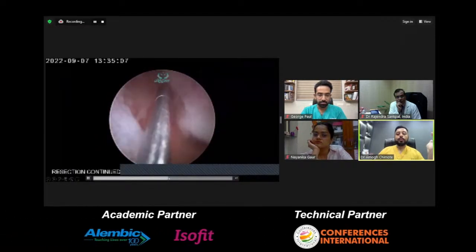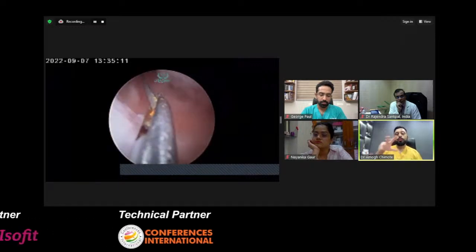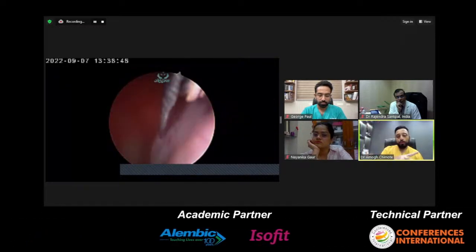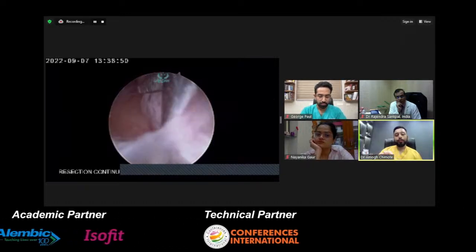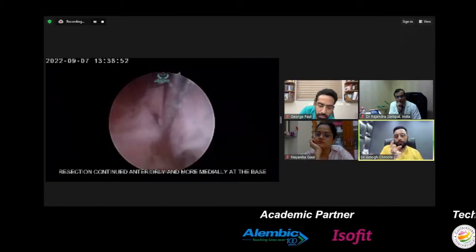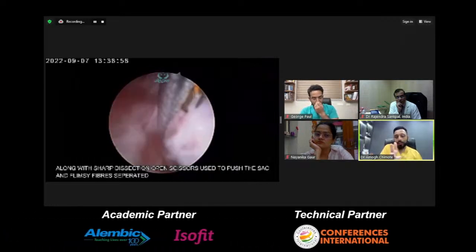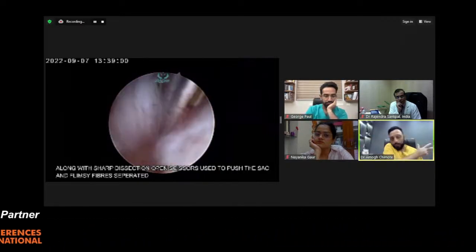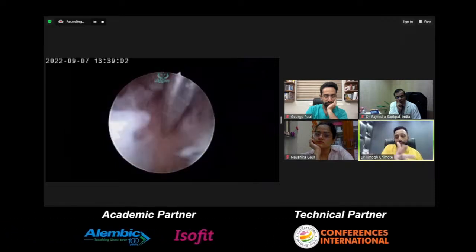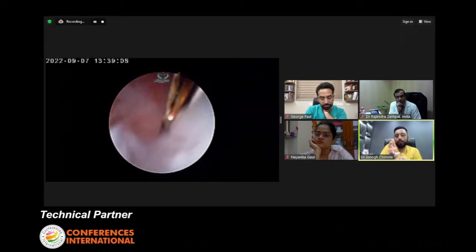Here, as you can see, the posterior aspect was still a bit stuck. So just open the scissors and push the sac. Don't apply too much force because it is a very delicate tissue. The movement that we do outside is just this with the fingers and the hands. You don't have to do like this or like this. Don't swipe it all the way around. It is a very delicate wrist movement that you need to do with the entire system in your hand.